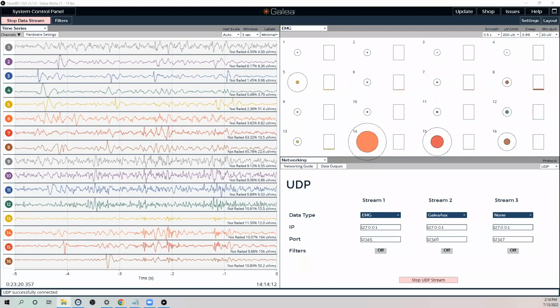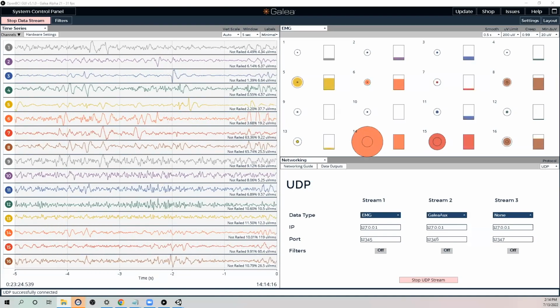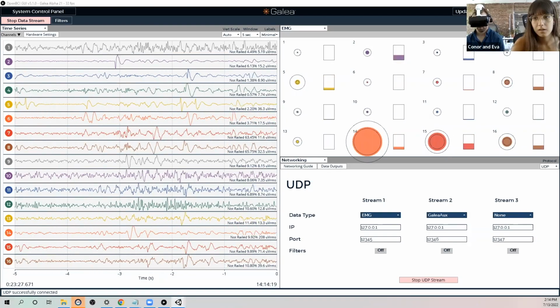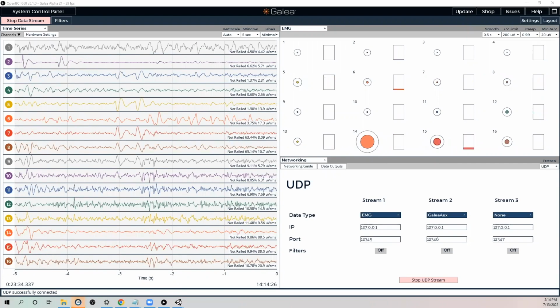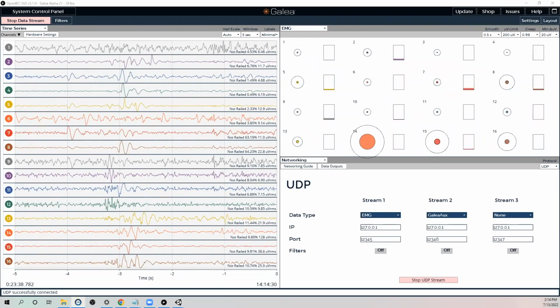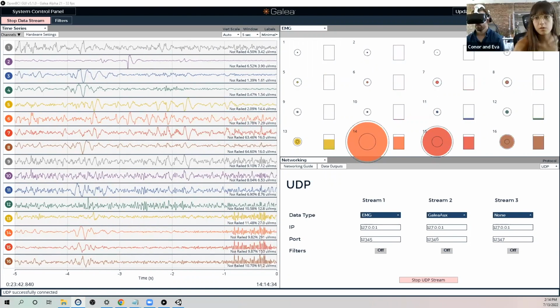We also tested out their headsets pretty extensively when we were selecting our headset partner for beta, and we were pretty happy about the performance of their eye tracking and also the range of data that they make available to you in their SDK and APIs without needing to pay for extra subscriptions or anything like that.